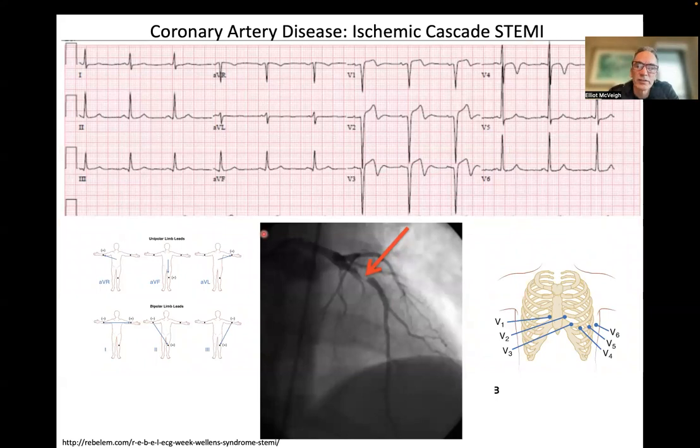And so here's an example where this patient, their coronary X-ray image, remember, we're going to inject a dye here, and the dye goes through the vessel, and then you get a projection image through the entire patient. But you can see at this point, it's a very valuable projection image, even though our resolution is low in the through plane orientation. Because of the dye, we get this great projection. And this you would call a 95% lesion, right? So you have a very narrow channel through which the blood is going. It does fill the distal vessel though, right?